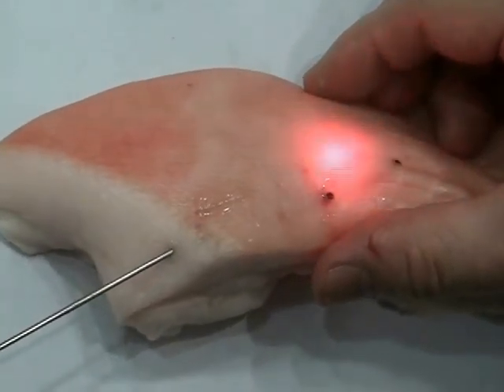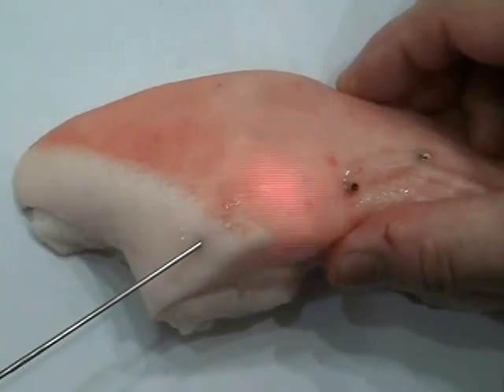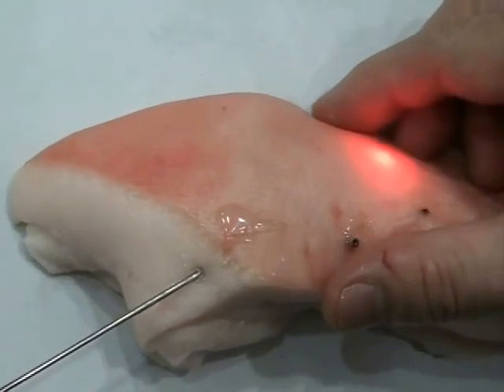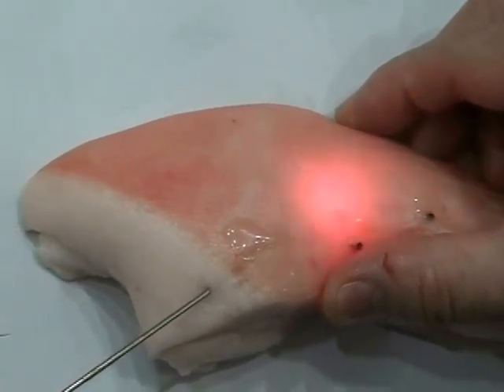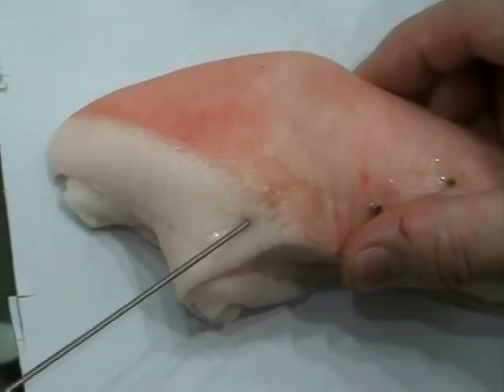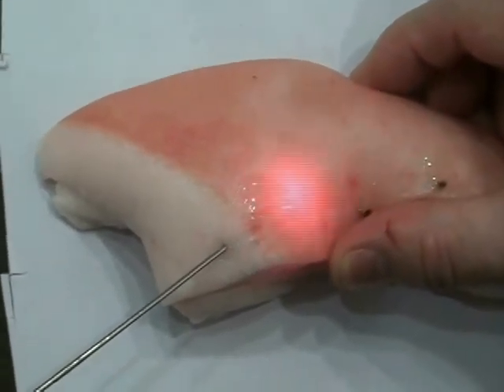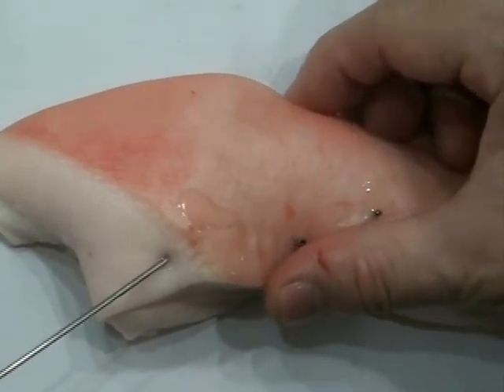When the cannula touches the subdermis and is pushed forward, the plasma light might burn the skin. So when moving the cannula forward, cover the fiber with the cannula without emitting plasma light. When moving the cannula backward, release the head of the handpiece towards its body and emit the plasma light. If you keep doing it this way, there is no worry about causing any burn. Also, the blood vessels are coagulated so as not to bruise after the operation.